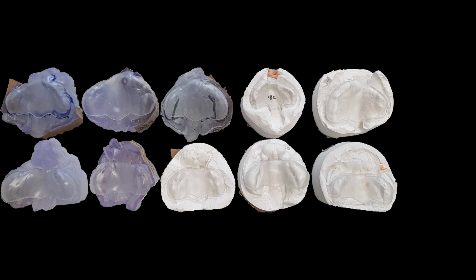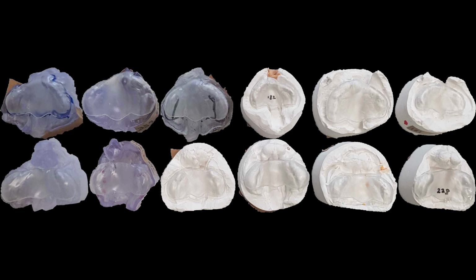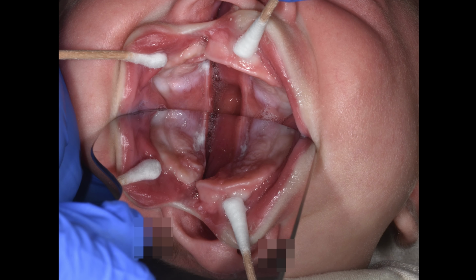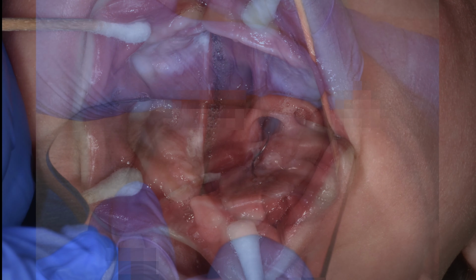We want to thank the University Hospital of Basel, Switzerland, and Savitha Medical College and Hospital, India for their cooperation. The photos depict the first patient being treated in Basel with a 3D printed model of our automatically generated plate. The nasal stent was added post-print.